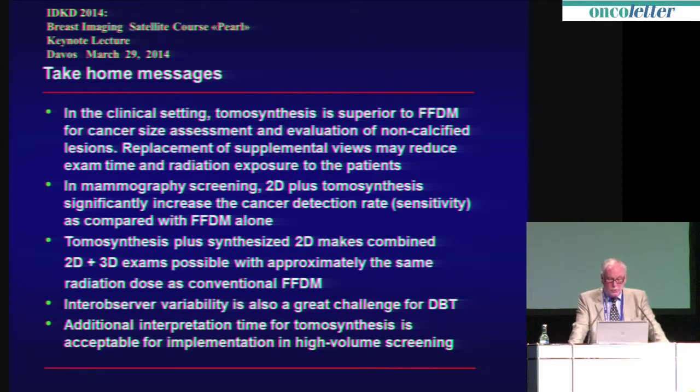And tomosynthesis plus synthetic 2D images make the combined use of 2D and 3D possible with approximately the same radiation dose as conventional FFDM. We do have the inter-observer variability problem with tomo in screening, as we had it with screen film and as we had it with digital mammography.